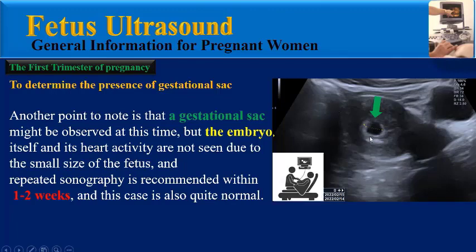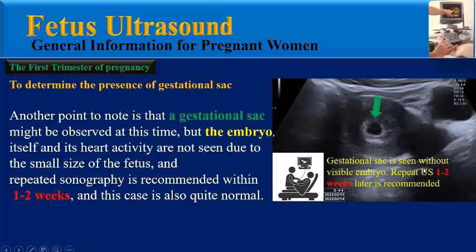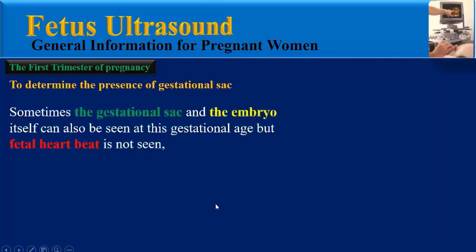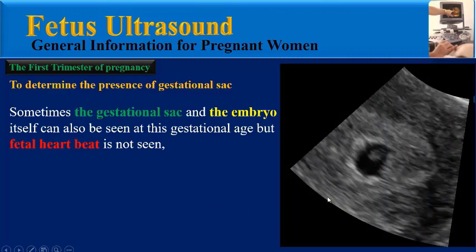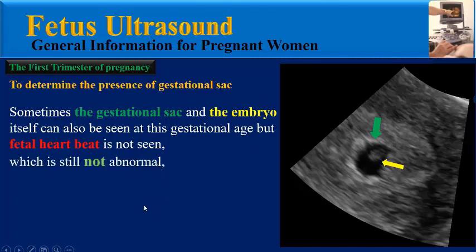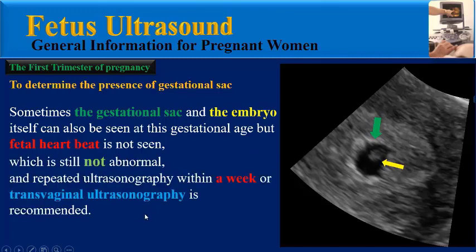As you can see in this image, there is a pregnancy sac in the womb but no fetus inside it. The physician reports: 'Gestational sac seen without visible embryo; repeat ultrasound one to two weeks later is recommended.' Sometimes the gestational sac and the embryo itself can also be seen at this gestational age, but the fetal heartbeat is not seen, which is still not abnormal. Repeated sonography within a week or transvaginal ultrasonography is recommended.